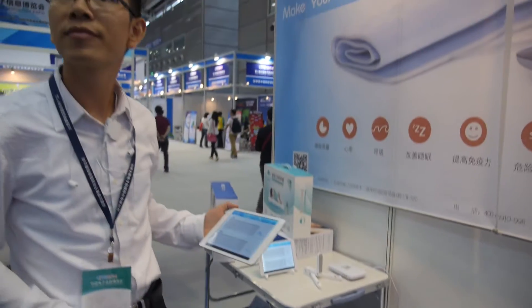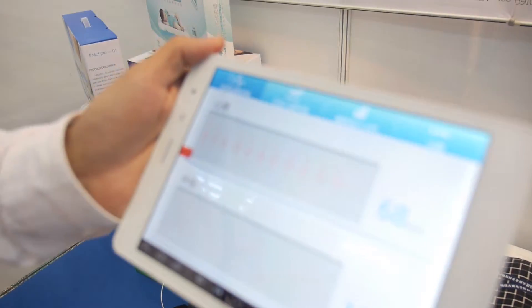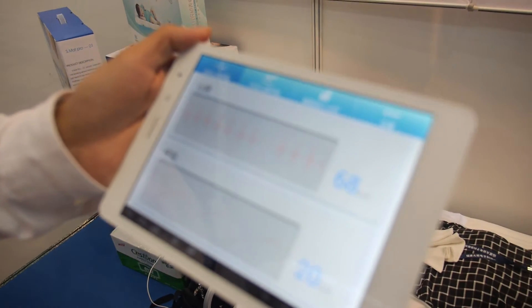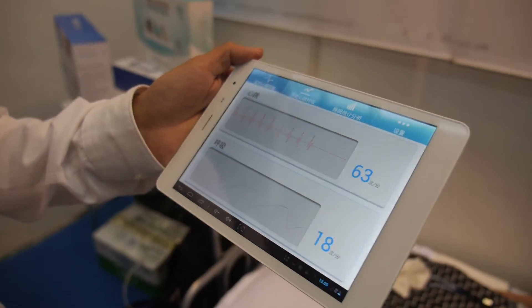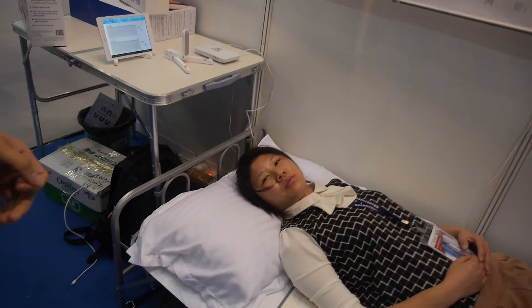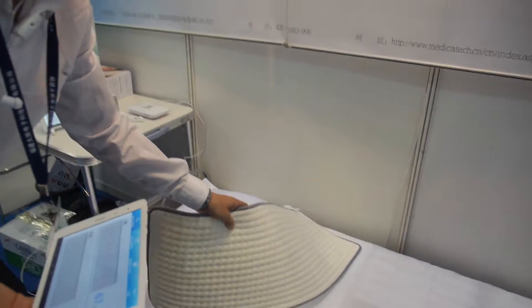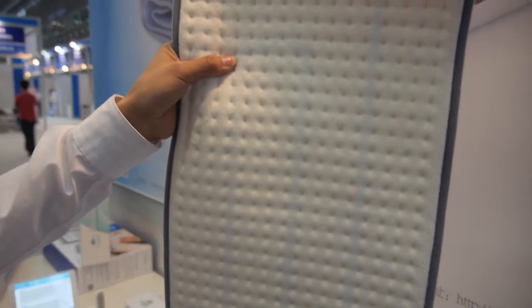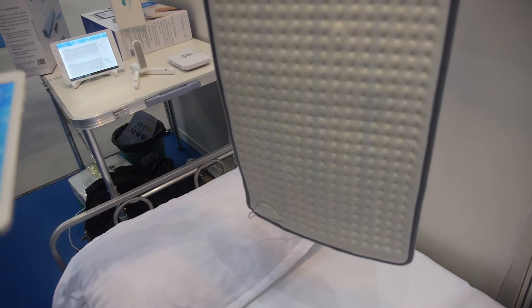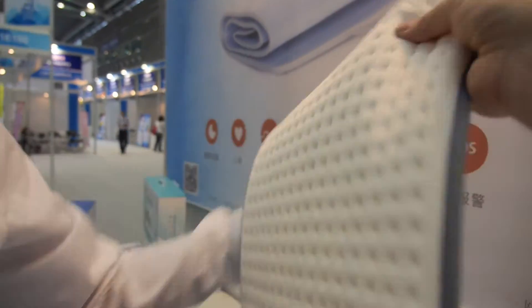This is a sleep monitor — it can monitor your sleep quality, your heart rate, your breathing, and your movements, and it will tell you your sleep quality next morning. This is a smart mattress, and we integrated a smart sensor inside. If you put this mattress on your bed under your sheets and lay on it, you can monitor. It's flexible and it cannot break.